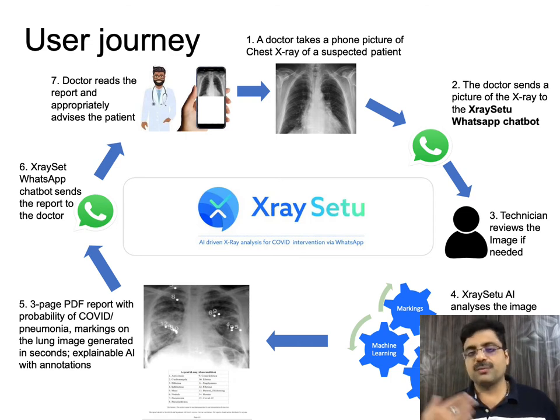While RT-PCR results or HRCT scan results were awaited, the doctor or X-ray technician would obtain consent from the patient to send a phone camera image of the developed X-ray film. They would generally capture the image in such a way that any patient information printed onto the film by the X-ray printer would be absent in the capture sent to the service. And even if by mistake any such information is present, the service ignores it.